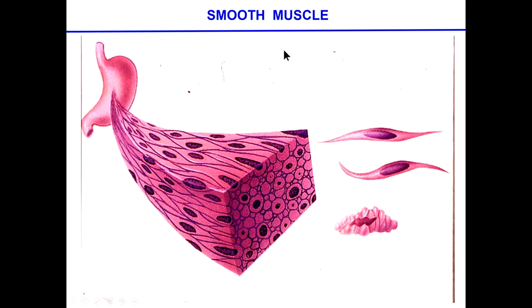This is now the smooth muscle. This is presumably indicating the wall of the stomach. We'll see that when we look at the GI system on October 18th. And the typical structure of the relaxed smooth muscle cell and the contracted muscle cell with the famous twisted arrangement of the nucleus, because it's the only way to solve the problem of not becoming enucleated in the process of contracting.